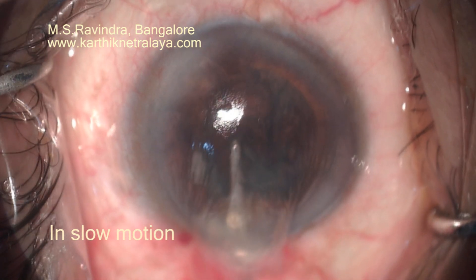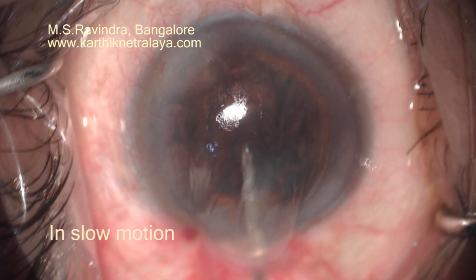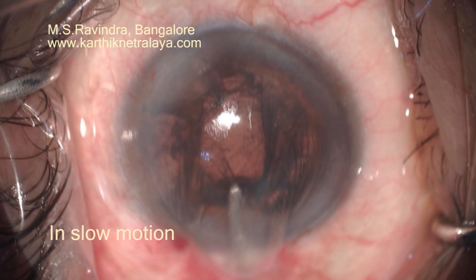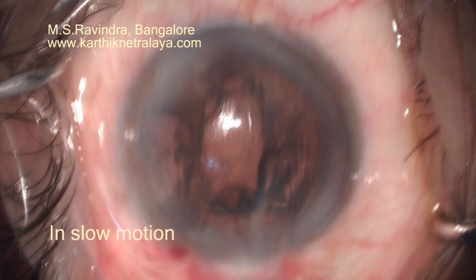So the tunnel opens up maximally, draining even larger particles from the anterior chamber. The draining cannula is kept in the floor of the tunnel, pressing it slightly, so that there is a free flow of material in an outward and downward direction from the anterior chamber to outside.